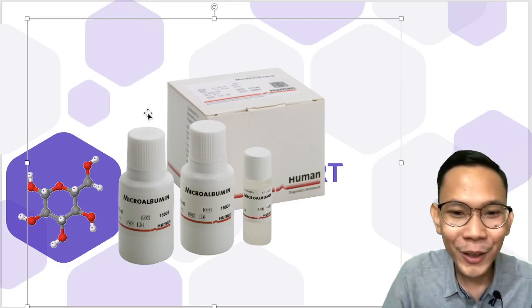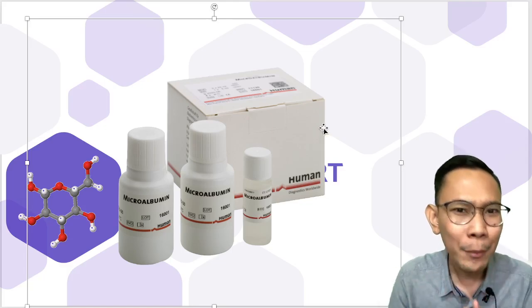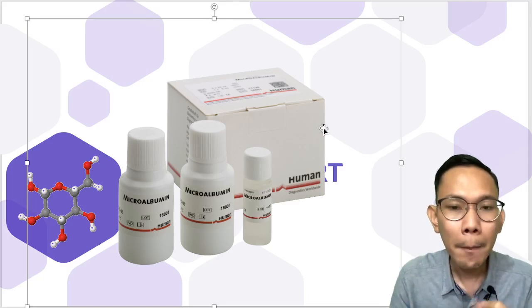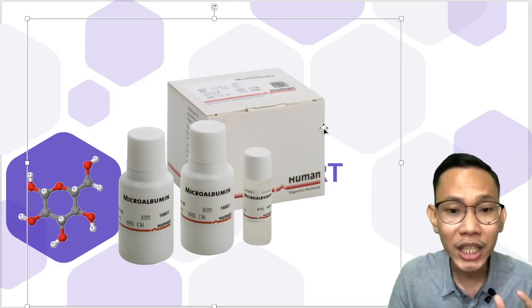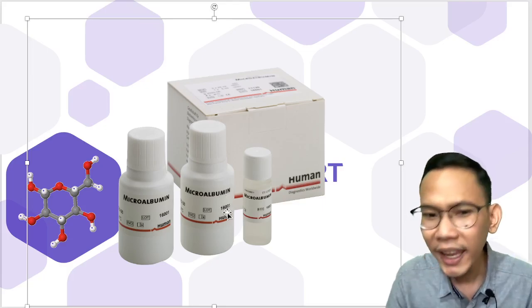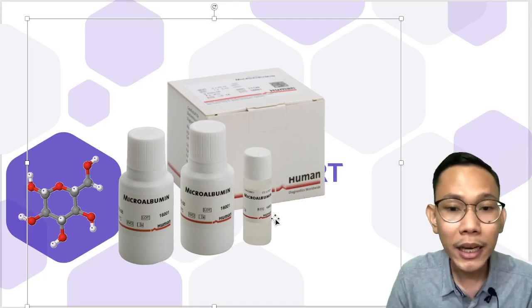So again, these are your different reagents. They are placed in a box, a separate box per test. For example, there is cholesterol, lipid, HDL, triglyceride. They are separate, and there are reagents inside, each with labels: RGT for reagent, STD, not the disease, for your standard, and so on. Depending on the test, they have instructions.